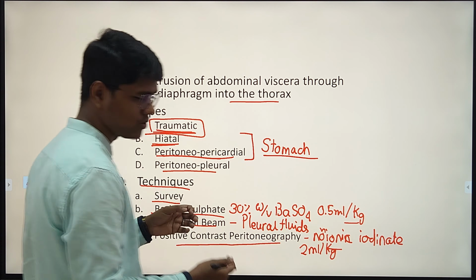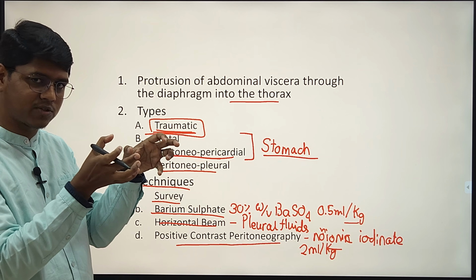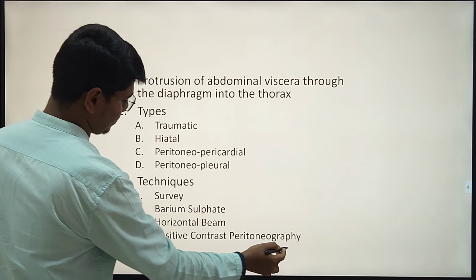After giving, you have to elevate the abdomen, that is the caudal side of the abdomen, so that all the contrast will be accumulated at the diaphragmatic surface. Then you can take X-ray, we will see some photographs also, radiographs also.